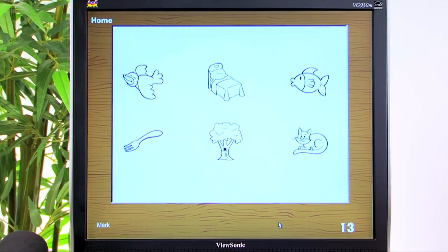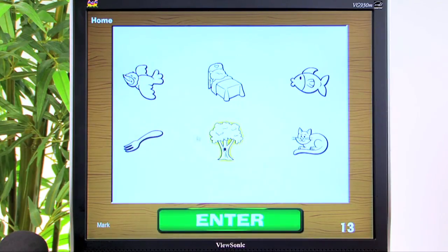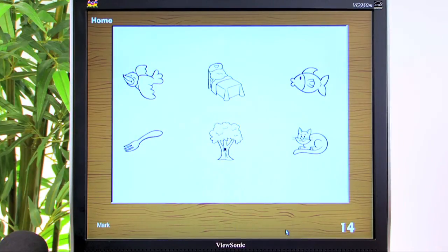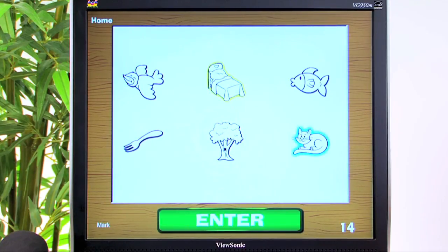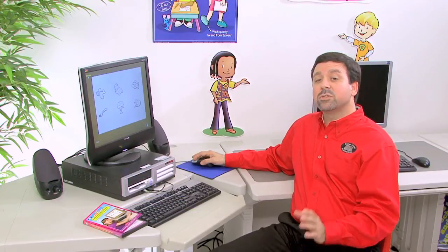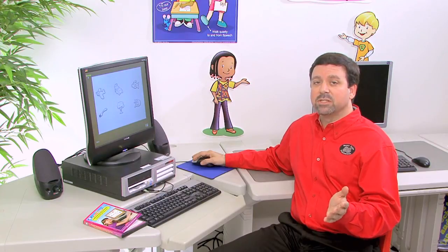First, click on the tree. Next, click on the fork. First, click on the bed. Next, click on the bird. And finally, click on the fish. So those are some examples from the Sequential Directions subtest.